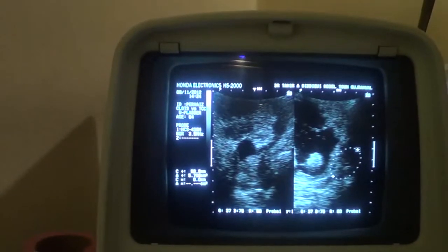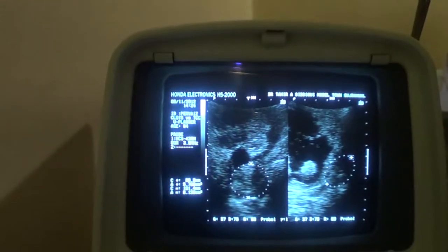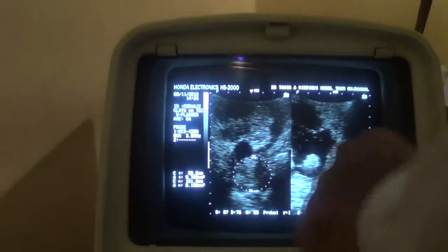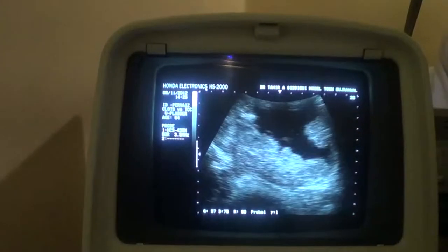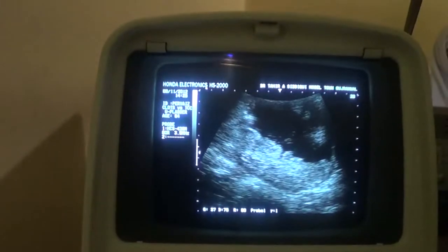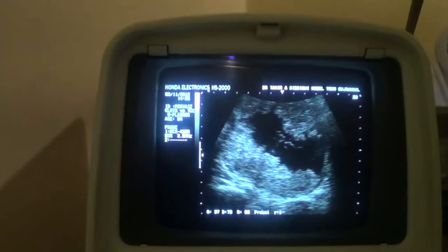So we cannot definitely inform the referring surgeon whether it's invading the areas outside the urinary bladder wall. That CT scan is a must for this patient. Now these encircled areas are the prostate. This is the longitudinal section, this is the transverse section, and above you are seeing the texture of the echogenic material layered out with the posterior wall, with the lateral wall, and a few echogenicities within the lumen of the urinary bladder as well.